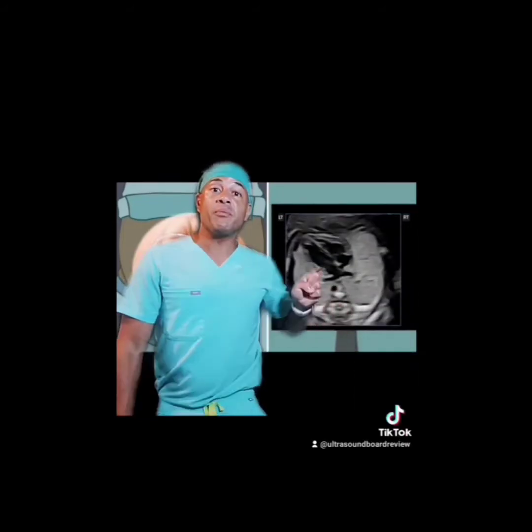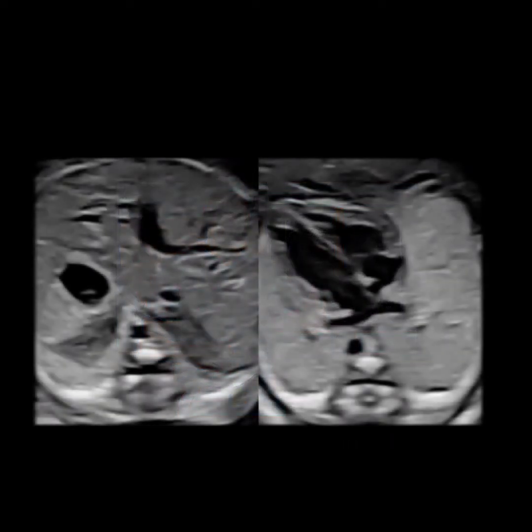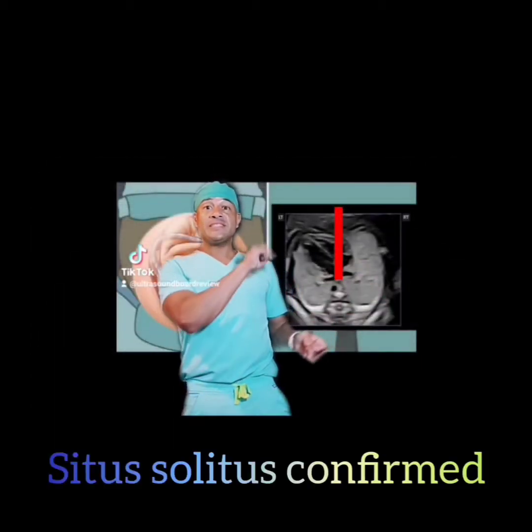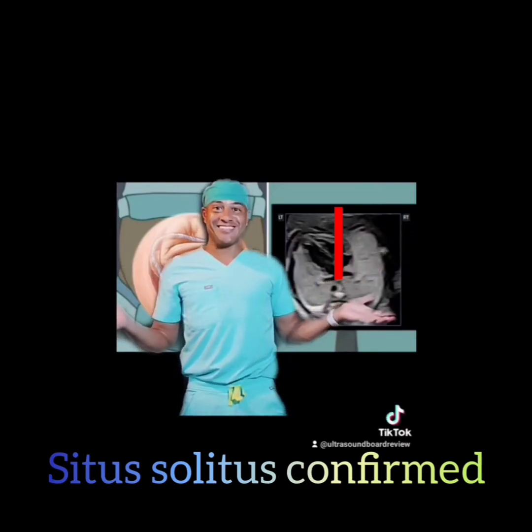Draw another imaginary line from the spine to the anterior chest wall. If you notice that the apex of the heart is pointing to the same side as the stomach, this confirms your fetal situs. Now we know that this is the left side, this is the right side, and this is going to be the cephalic presentation.